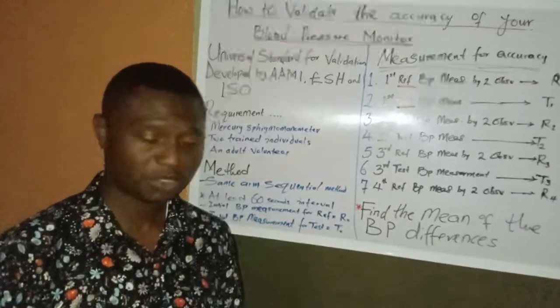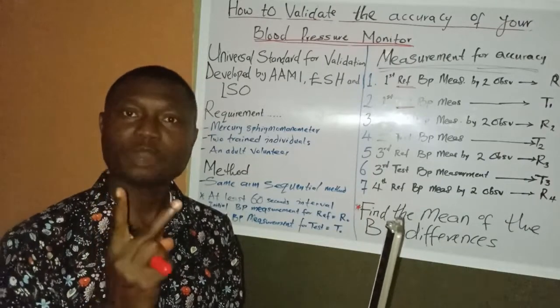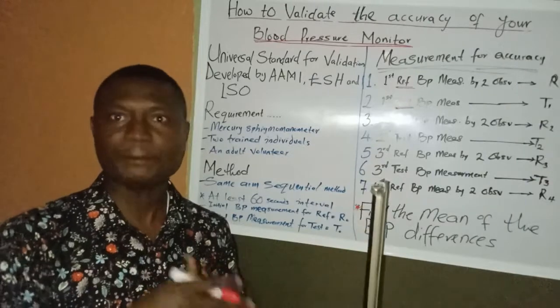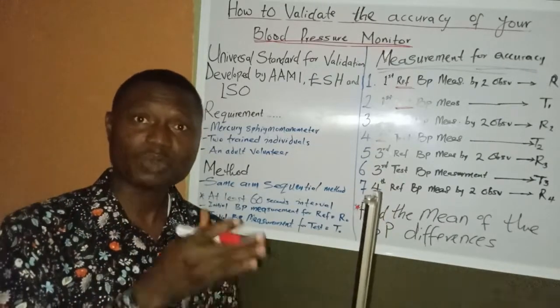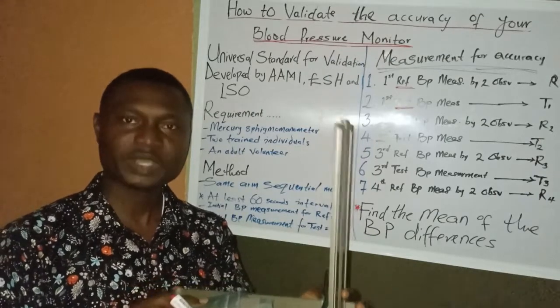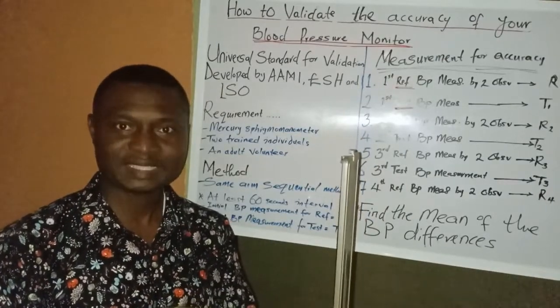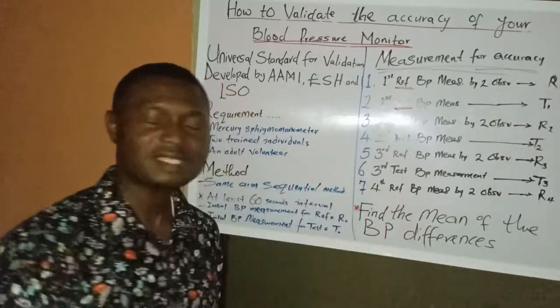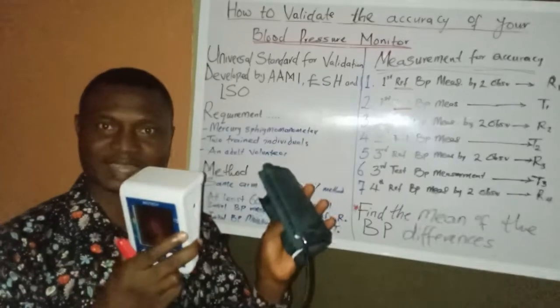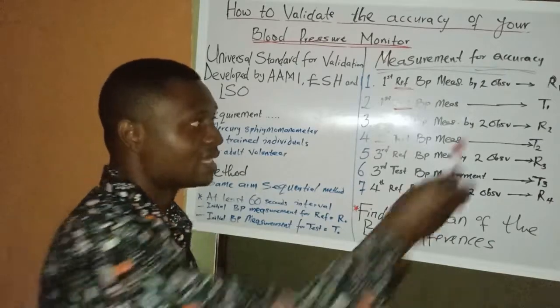After discarding the practice readings, we proceed to the main readings. Both trained individuals use the mercury sphygmomanometer on the same arm sequentially — observer A measures, then after 30 seconds observer B measures. They are blinded to each other's readings. We find the average of their two readings and record it as R1, our first reference value. We then pick up the test device and use it on the same arm, recording that value as T1.